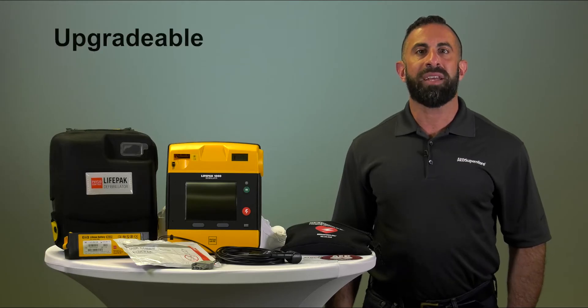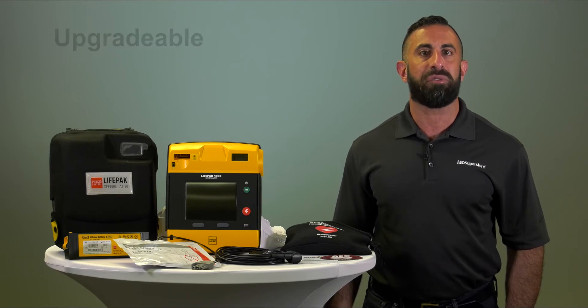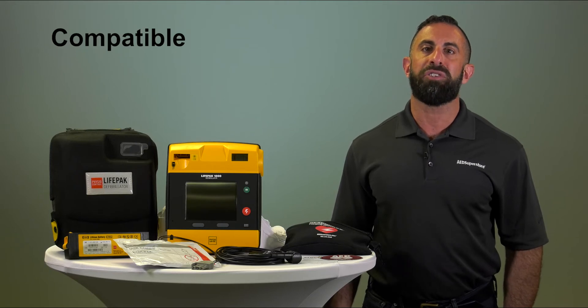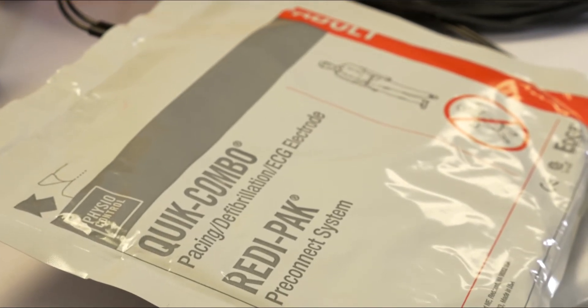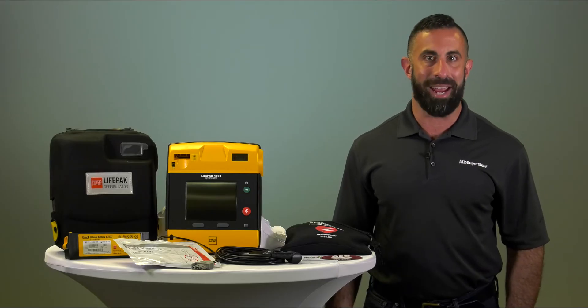The LifePak 1000 is upgradable and future field therapies will build on its defibrillation platform. This professional AED is compatible with all other PhysioControl devices, and the electropads from other PhysioControl devices are interchangeable, which allows you to save time during transfer of care from lay rescuer to EMS advanced care.